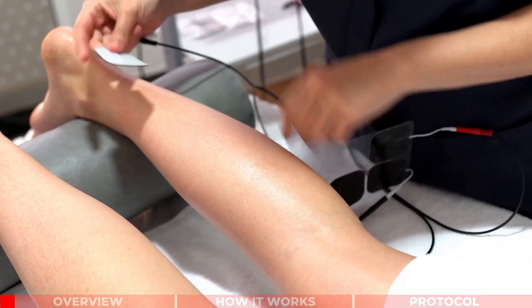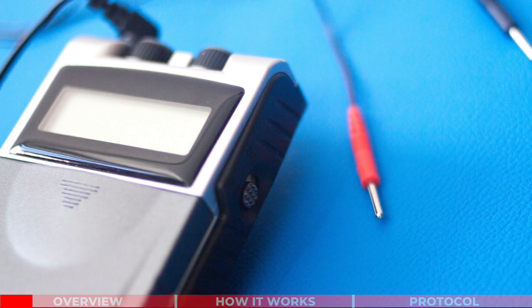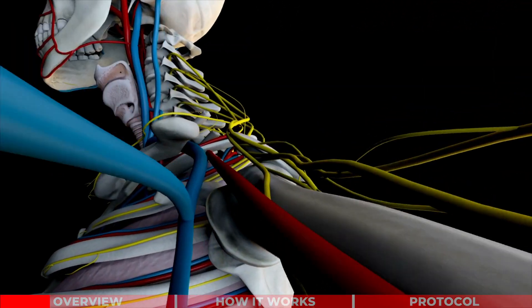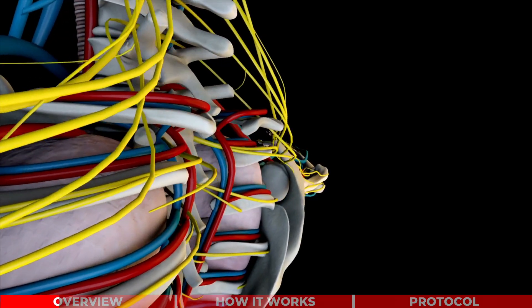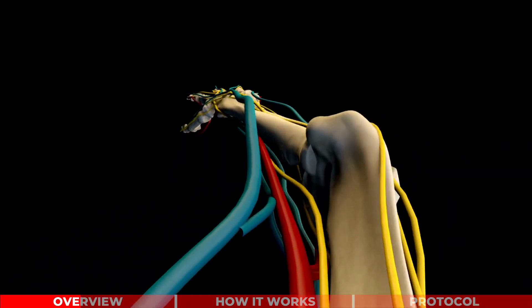Electrical stimulation involves the application of electrodes to our skin. A small and portable TENS machine can deliver electrical current to our body. This can stimulate our sensory and motor nerves, leading to increased circulation, removal of toxins, and most importantly, pain reduction.